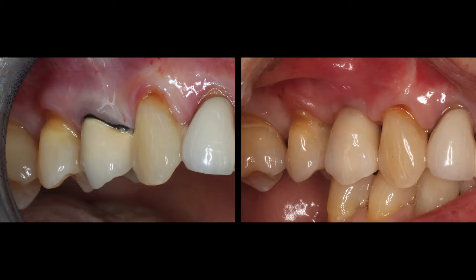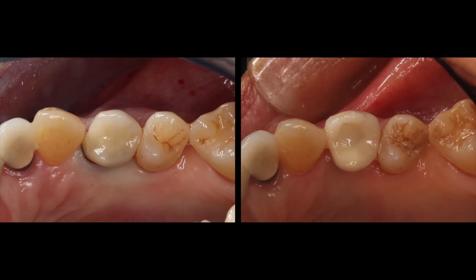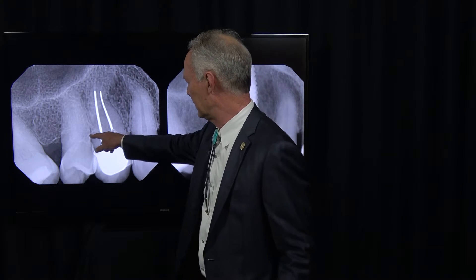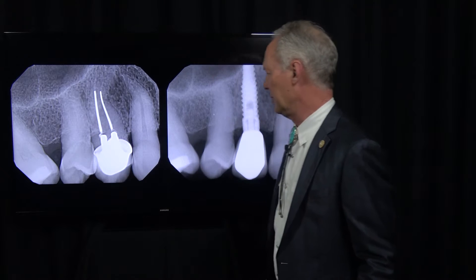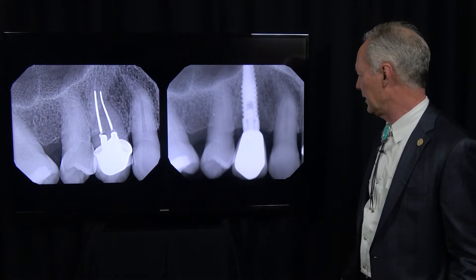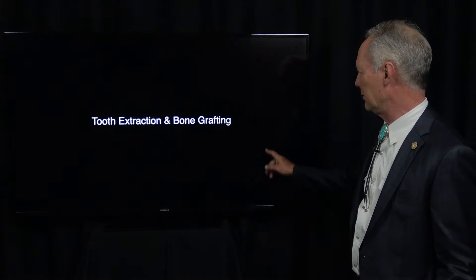Here's our tooth, and here's our final restoration. This tooth had fractured horizontally right at the tip, at the apical portion of the post. And here's the final implant and screw-retained abutment and crown.